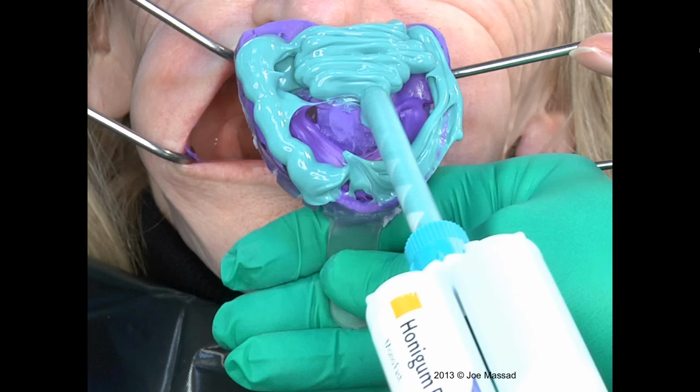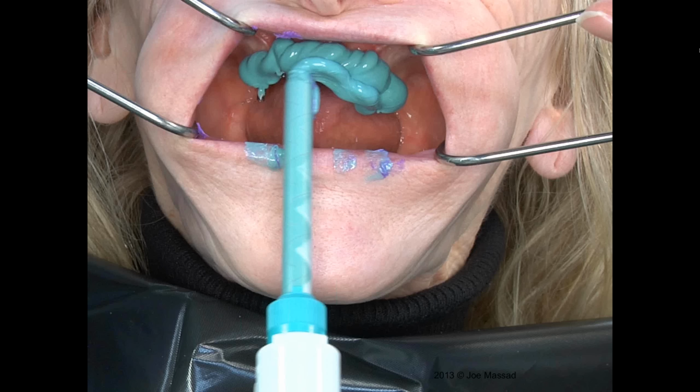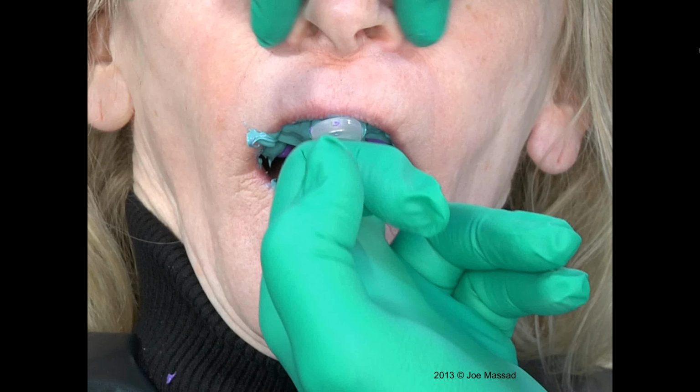And this is about a 2-minute set on the final material here. And then I should be able to take my finger and take all the material off wherever the heads of the locking screws are. You can see those right there. So now I can retrieve those very nicely.